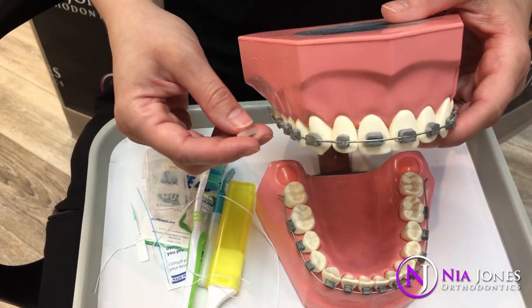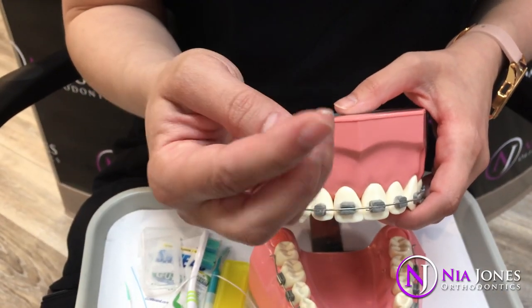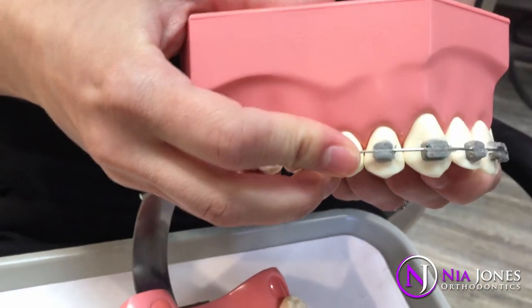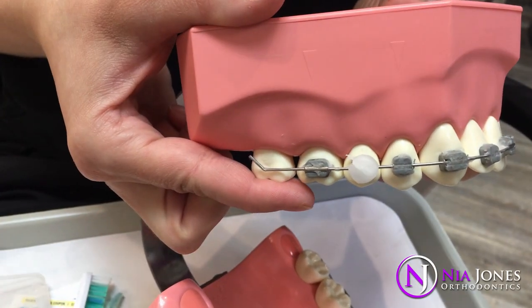If you have anything poking or bothering you, what you'll use is the wax to help make everything more comfortable. You peel a piece of wax out of your container, roll it into a ball, and press it down on top of whatever is bothering you. It makes a nice little cushion for your lip and cheek to slide right over.